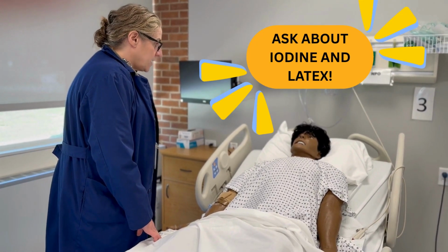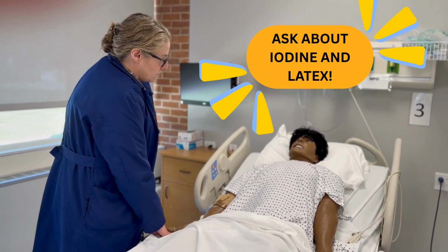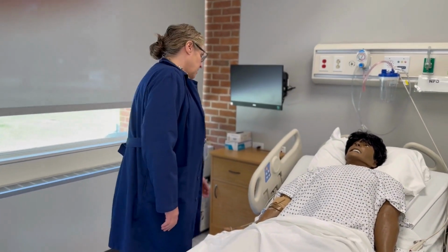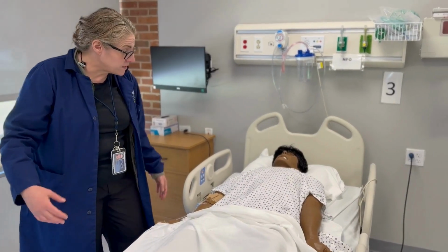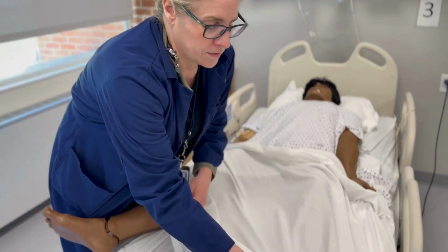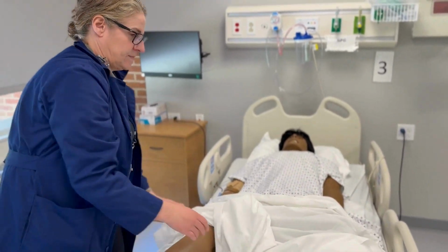Are you allergic to anything? Iodine or latex? No, that's good. Okay. Assist the patient into a supine position with thighs apart. I'm going to just lower your head, Sydney. I'm going to just open your legs a little bit so that I can work in between there. Okay. Put on clean gloves.